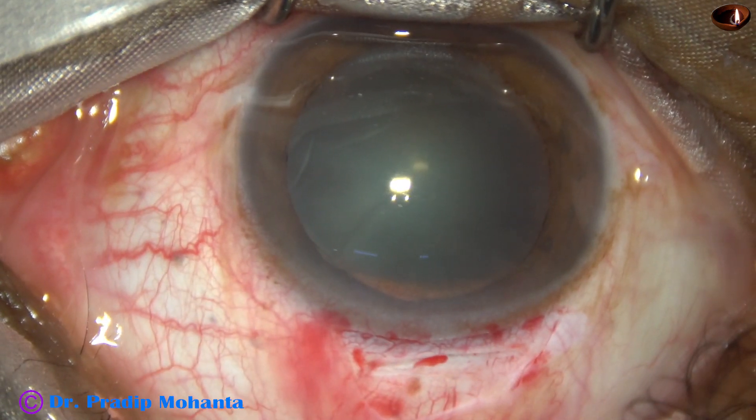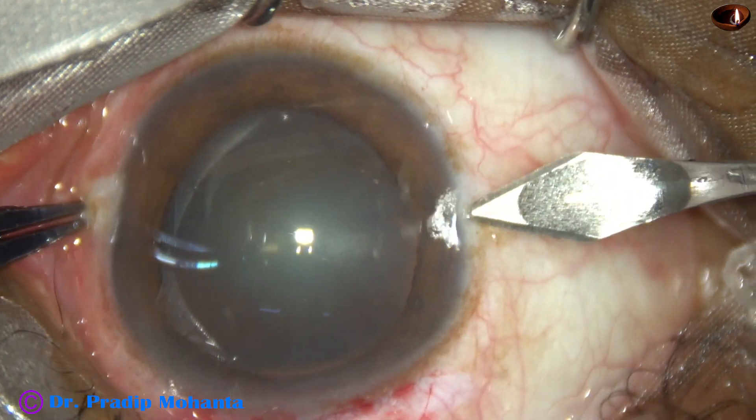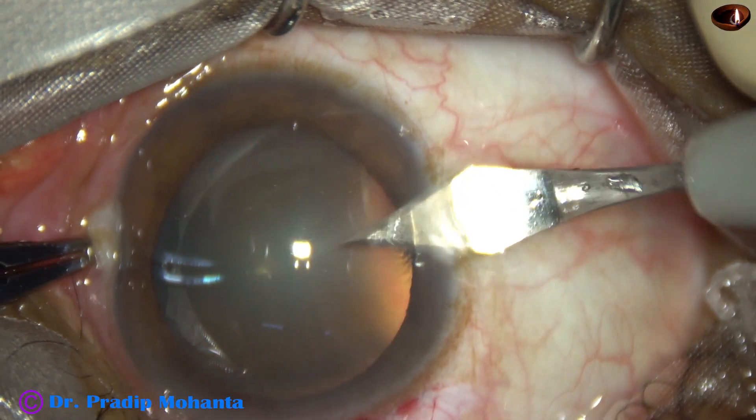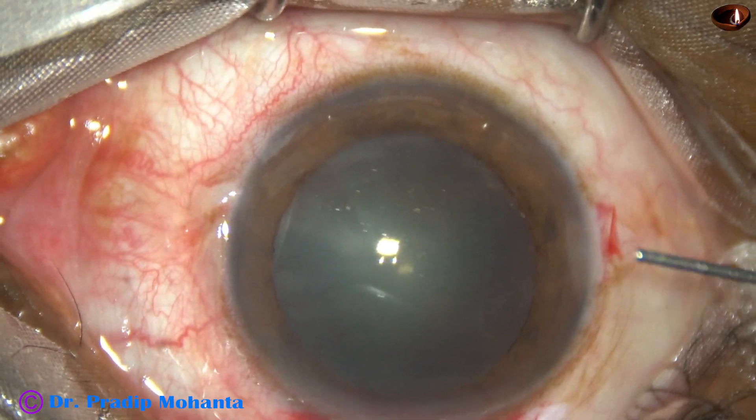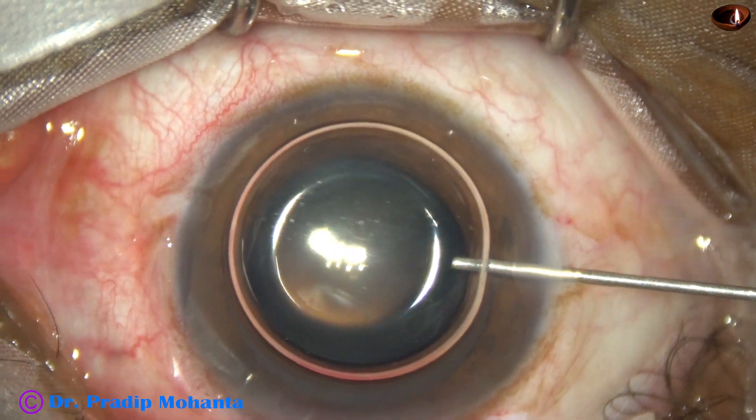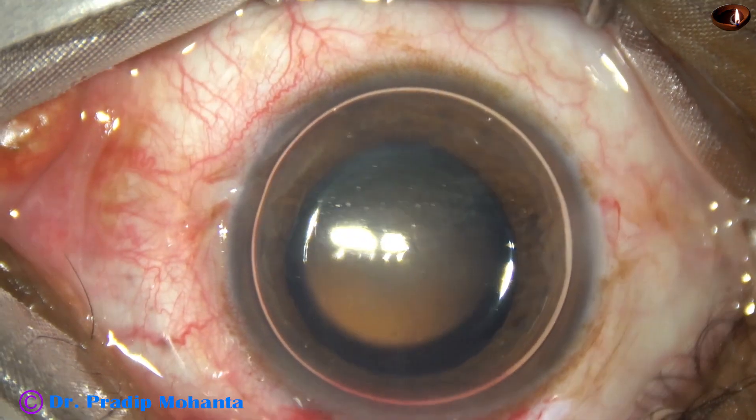Now this is a side port at around 9 o'clock. The size of this side port is about 2.2 millimeters. And this is an air bubble.